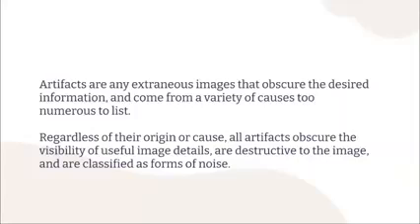Artifacts in the image can also be created by the imaging process itself. Scatter radiation is one example. So when you expose the patient, it is inevitable that scatter radiation will be produced. So during the imaging process, scatter radiation is there. It depends on whether it is increased or minimized.